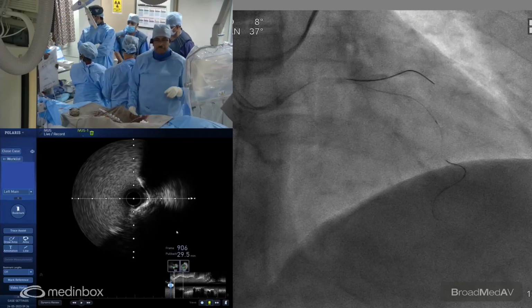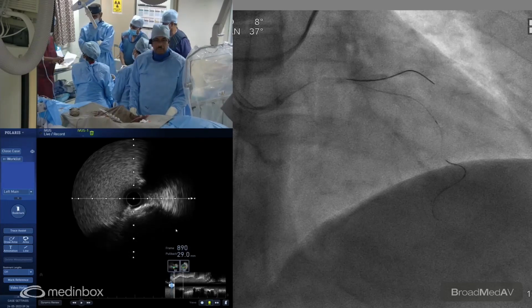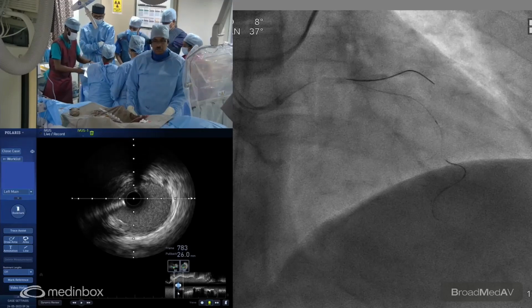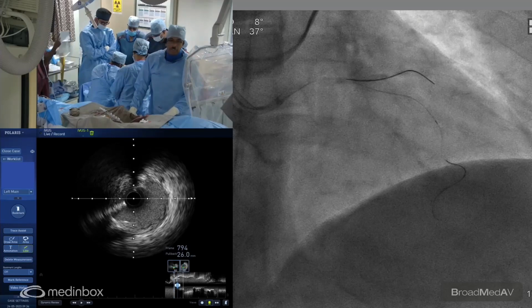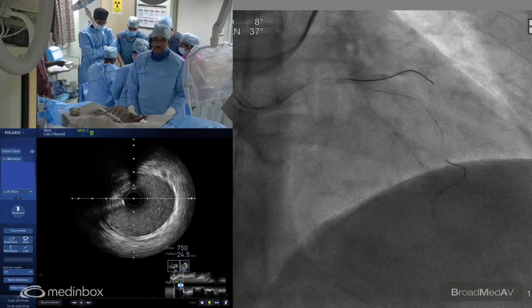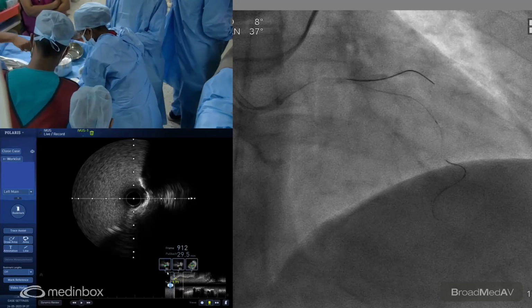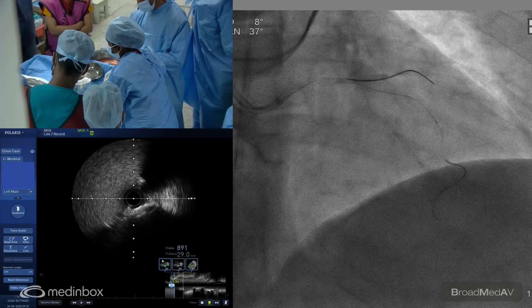So you have 3 parts of the IVL: the catheter, which has to be prepped like any balloon, with the components having the ultrasound at the tip. We have the catheter attached to a connector, which is a cable that connects to the power source. And then what we really do is deliver pulses. These catheters can deliver about 80 pulses, that is 8 cycles of 10 pulses each. I hope that we can use all the 10 pulses each time.